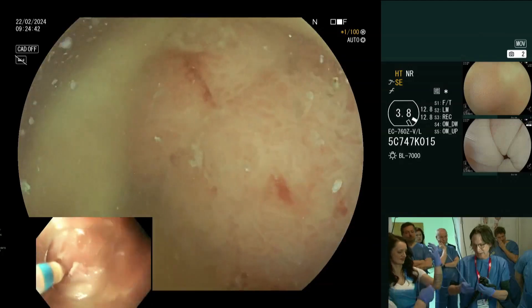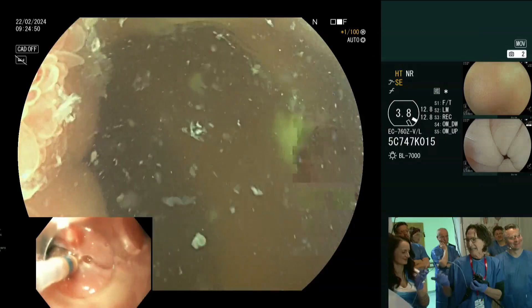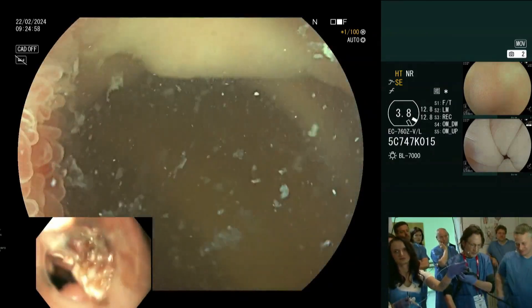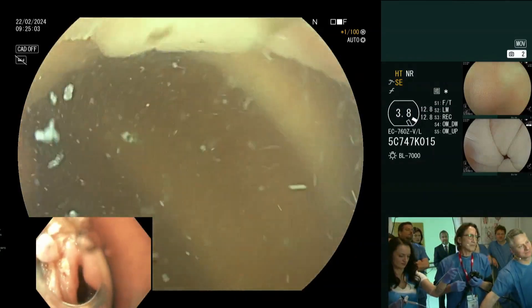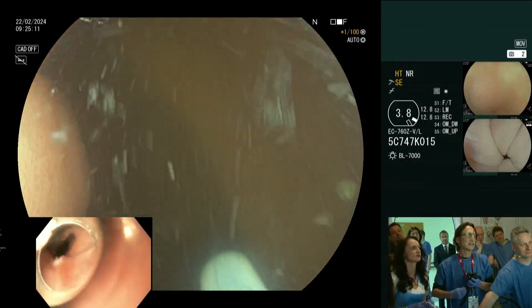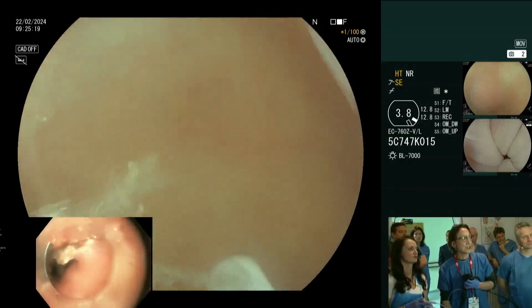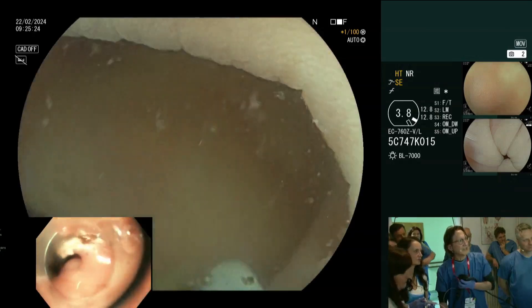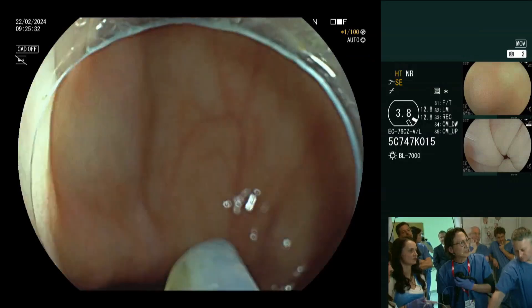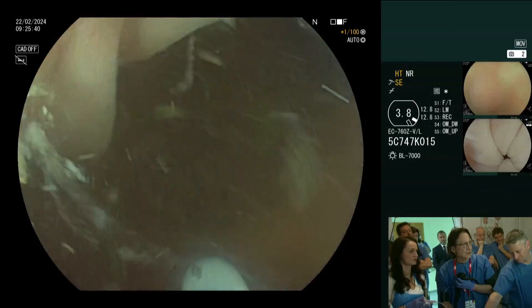I have assisting me Andrea and the two Joannas. This is a Captivator 2 snare. Boris is to my left — I'll have him hold the scope at the patient's anus so it doesn't slip back. When you have a lesion at the IC valve, I always use an adult colonoscope because I want to be able to suction alongside my snare. We want to get the lesion at 6 o'clock if possible. I have to admit the image is a little foreign to me with this scope — always a difficulty when using a different scope than the one you're used to at home.